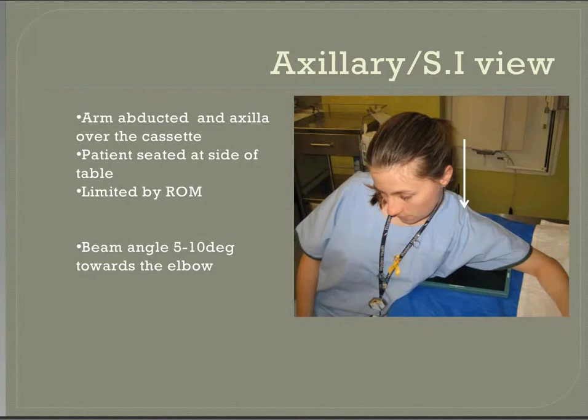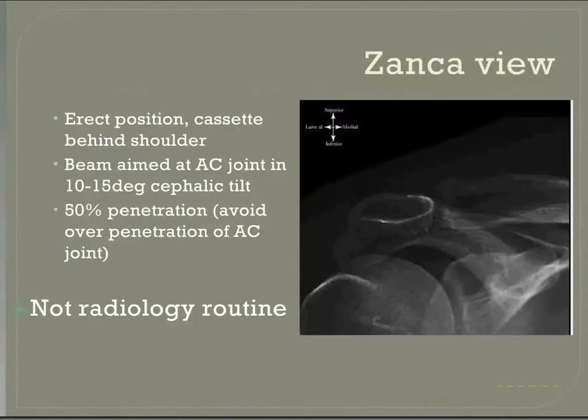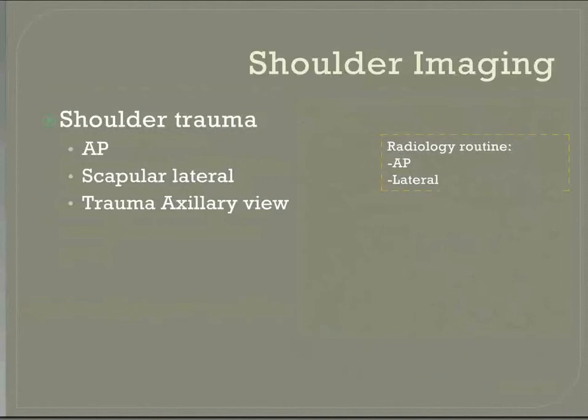Yeah. Could I ask you just about the emitter? Presumably, should be able to get a view straight up through the axillary with very little abduction. I don't know the emitters actually. I think our tube heads should be pretty much the same. I don't think it's really changed in size. As long as I've been here 16 years, it's quite big and bulky. You need a very small one to get shooting up.